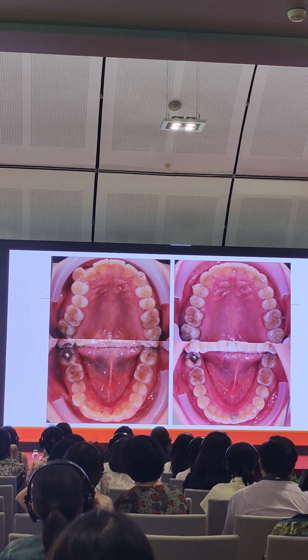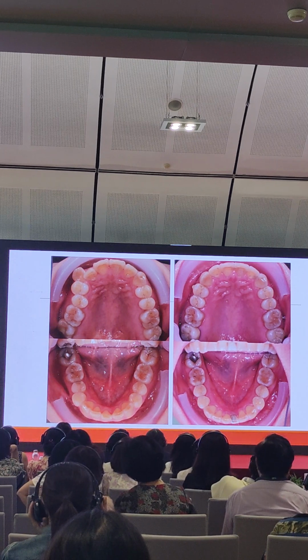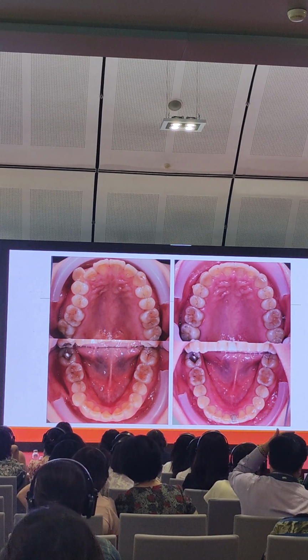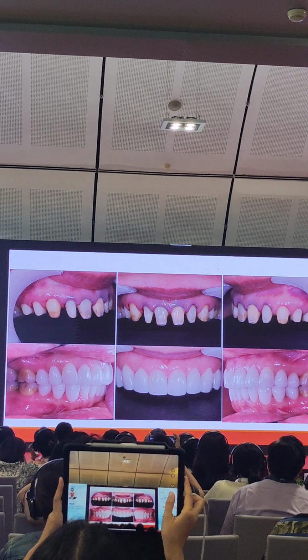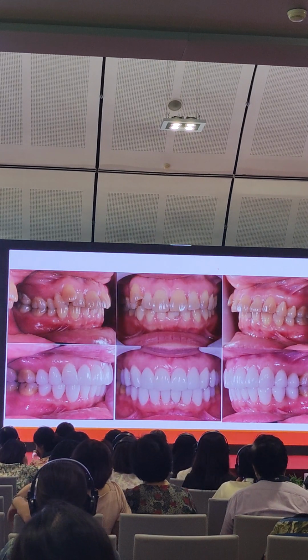Okay, so I just keep this tooth, and during the treatment, sometimes with the other tooth movement, because that tooth is not moving, we need to adjust it to fit in. Okay, so crowding is already resolved. So what I need to do next is I select to do crowns for the patient. That is the change.